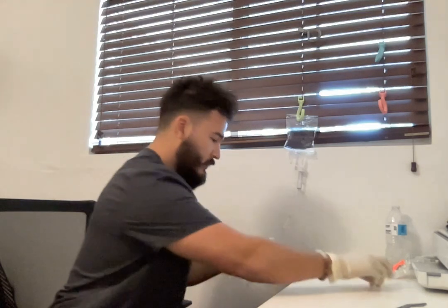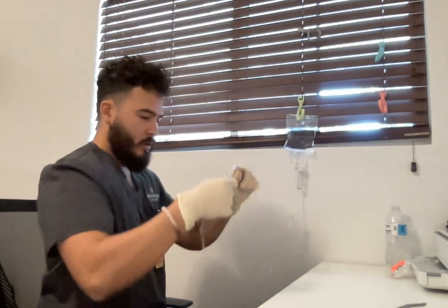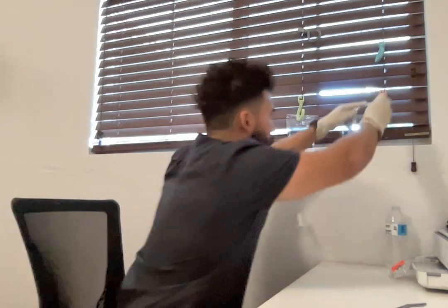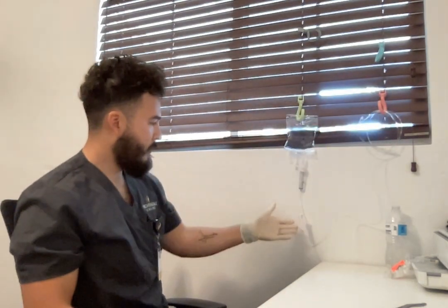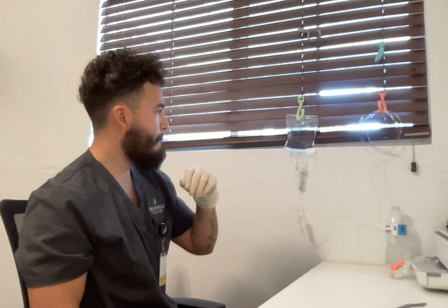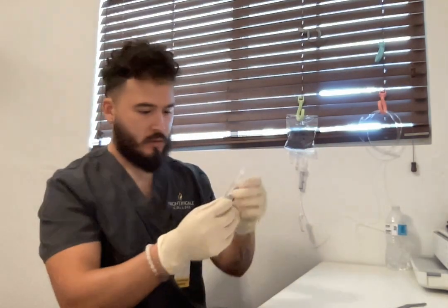So now that's done, I'm gonna put a cap back on. And then, so this doesn't get kinked up, I'm gonna hang it right here. So 38 drops per minute, fully clamped, and it's hanged. All the air is removed from the line. And yeah, now let's set up our medication bag.